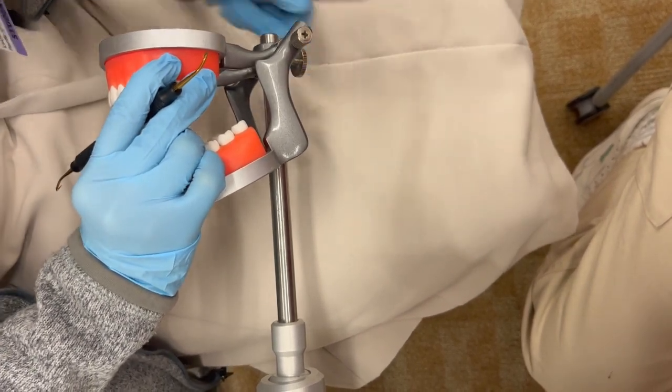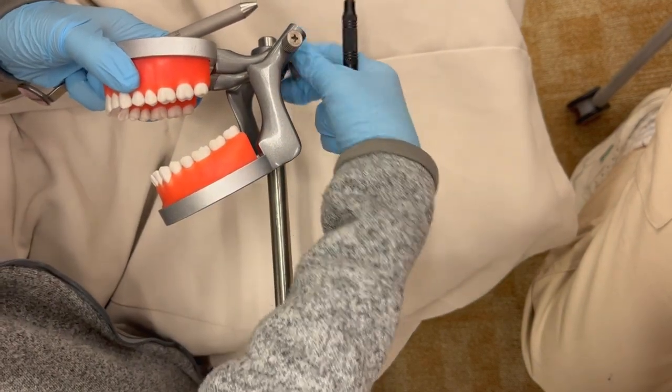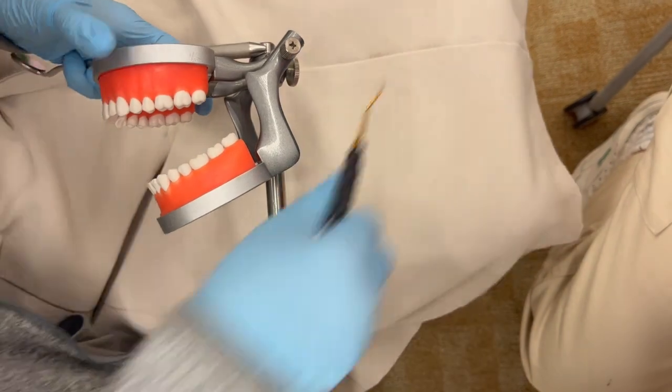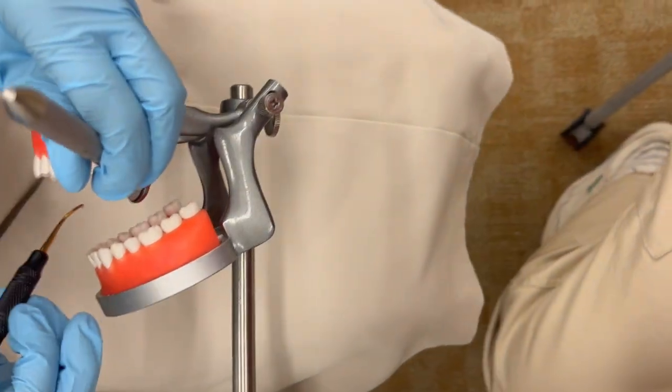You want to make sure you establish angulation. So face to tooth surface angulation is 70 to 80 degrees, and the correct angulation is achieved by tilting the lower shank towards the tooth surface. So you want to remember me: my patient, my light, my mirror, my grasp, my finger rest, my adaptation.